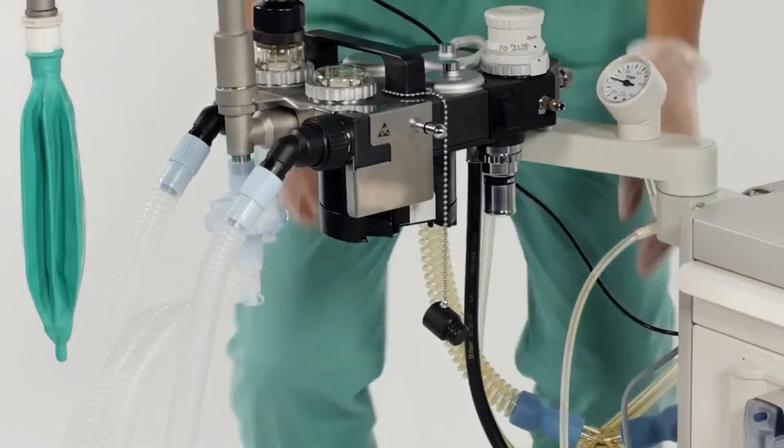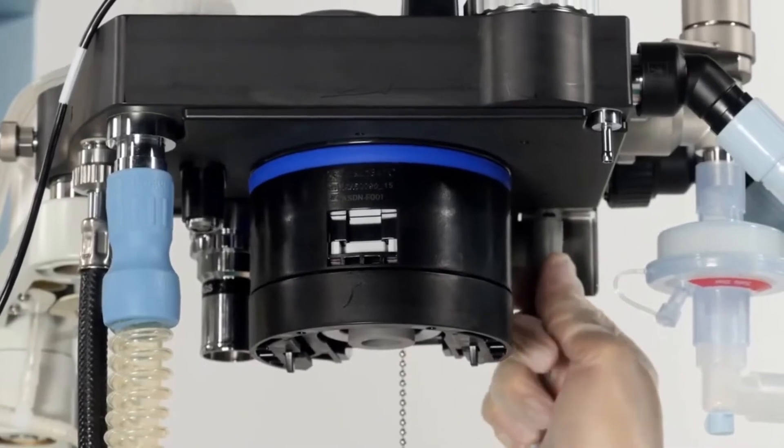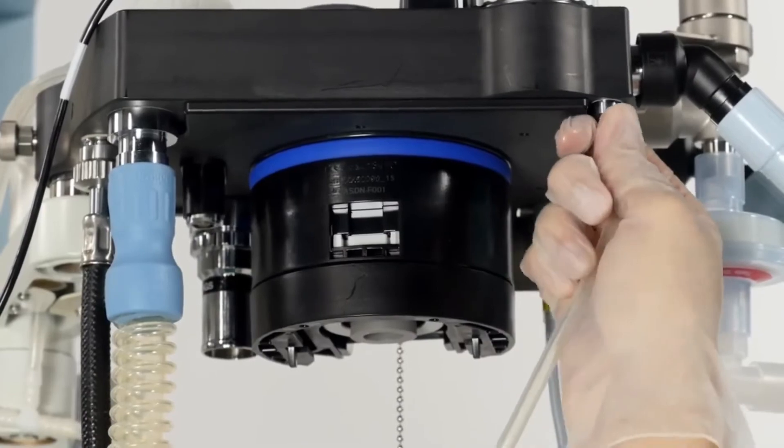Connect the volume line cable and press the pressure measuring line onto the corresponding connector on the underside of the breathing system. Do not squeeze the pressure measuring line during installation.